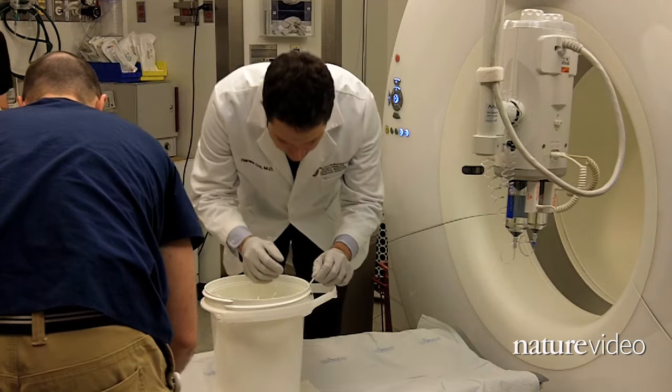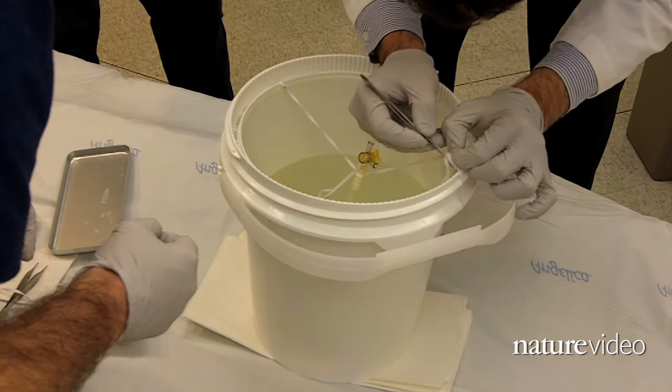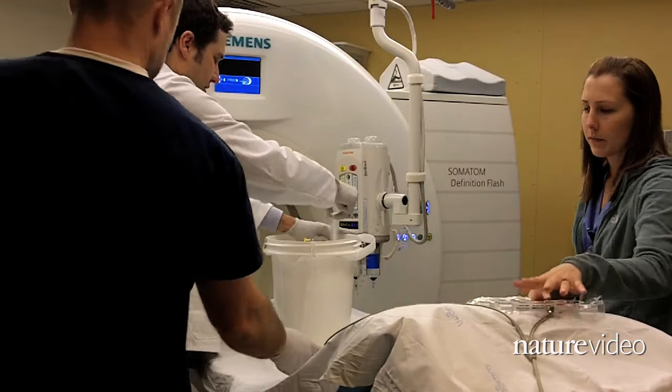They use a CT scanner at the hospital next door to take a look at their work. Harold pumps contrast fluid through the aorta to check for backflow and to see if the arteries that feed the heart muscle leak.